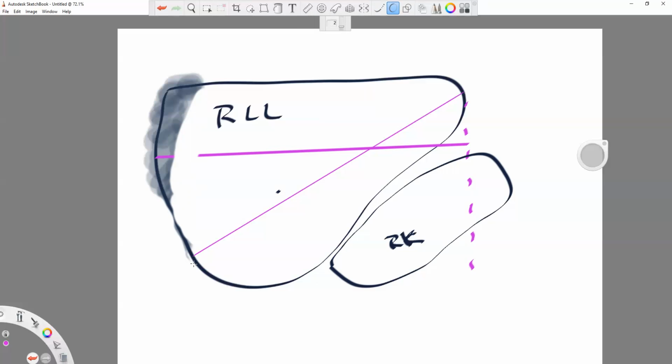Rather than having it shadowed all the way down to the very posterior edge, maybe just some shadowing on this top corner. And so at this point now, we can measure something a little more like that. That is my compromise to two worlds. The world in which everyone in the world is doing this.